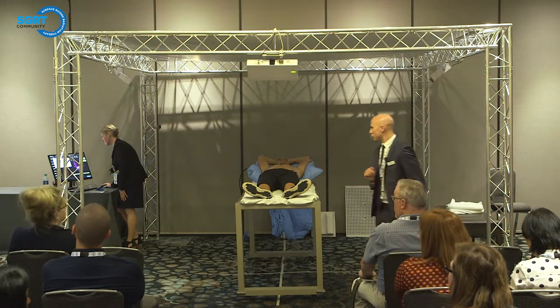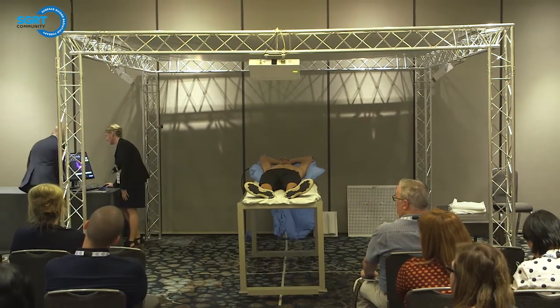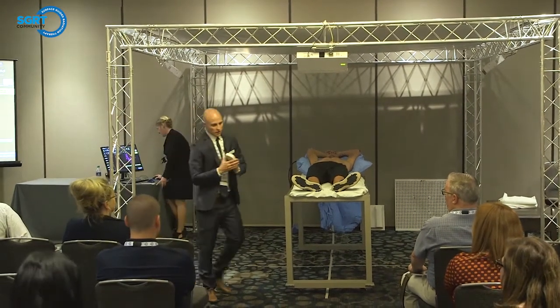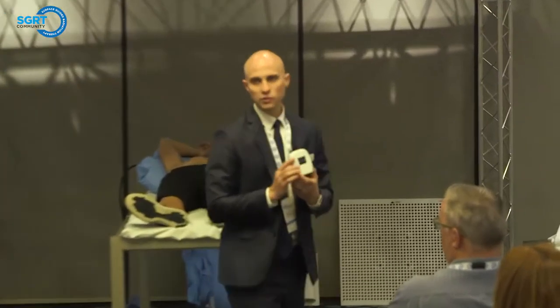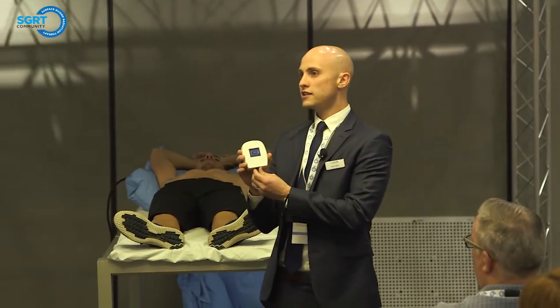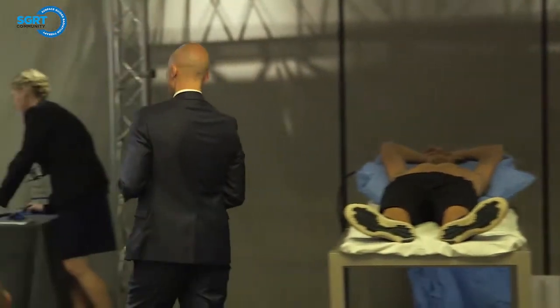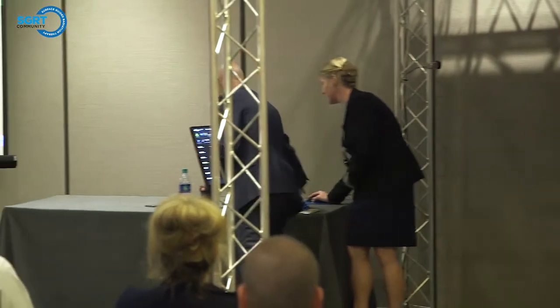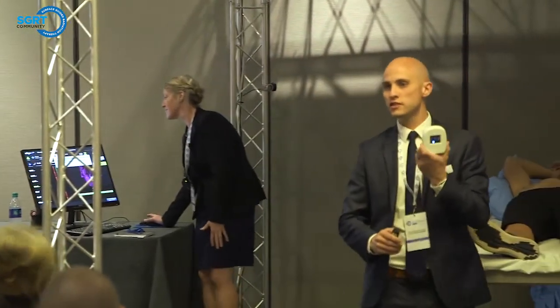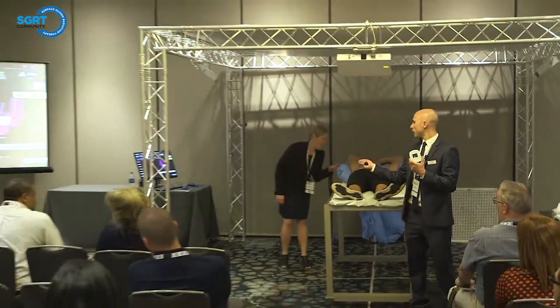Okay, so to start off DIBH, the first thing I want to talk about is this real-time coach device that we have. This real-time coach is only used for deep inspiration breath hold technique. The 2D plotter you see in the bottom right-hand corner of your screen is going to be replicated onto this device for the patient to see during treatment.